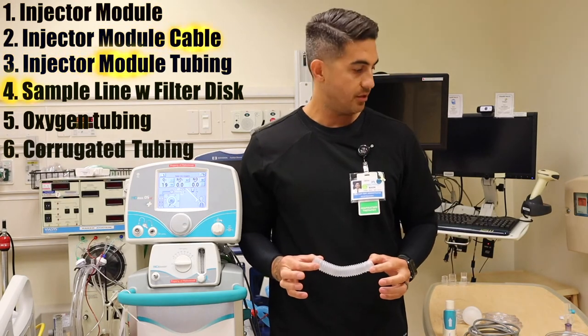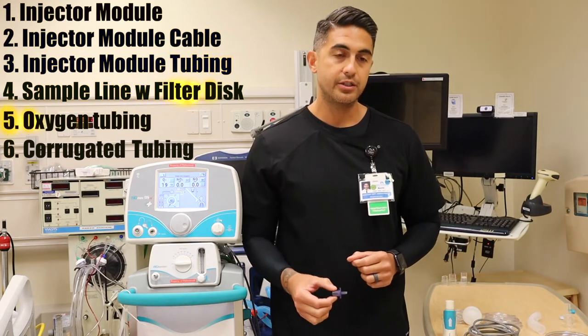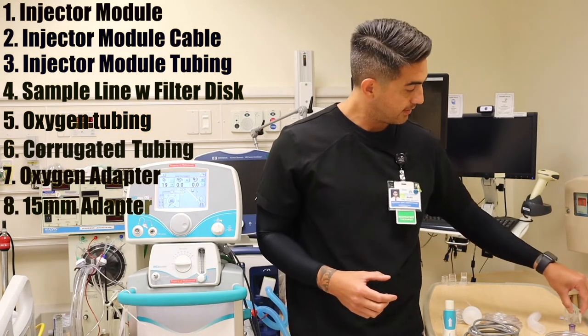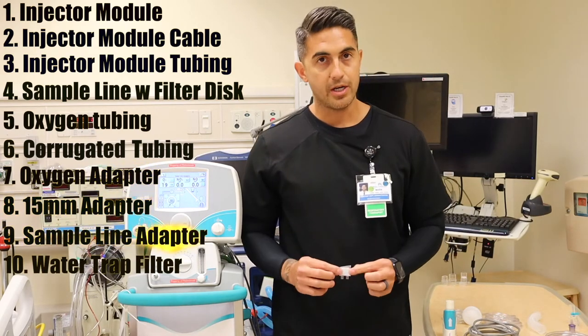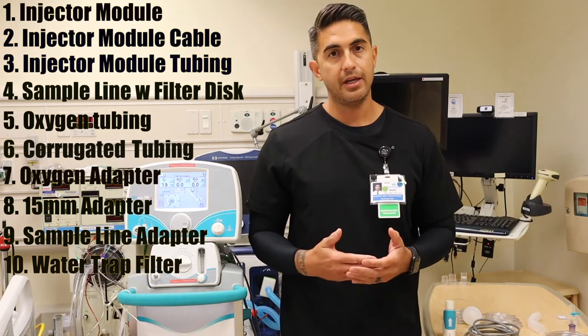You have one piece of corrugated tubing, an oxygen adapter, a 15mm adapter, a sample line adapter, and a water trap filter. These are all the components needed to put together a pre-use assembly circuit.